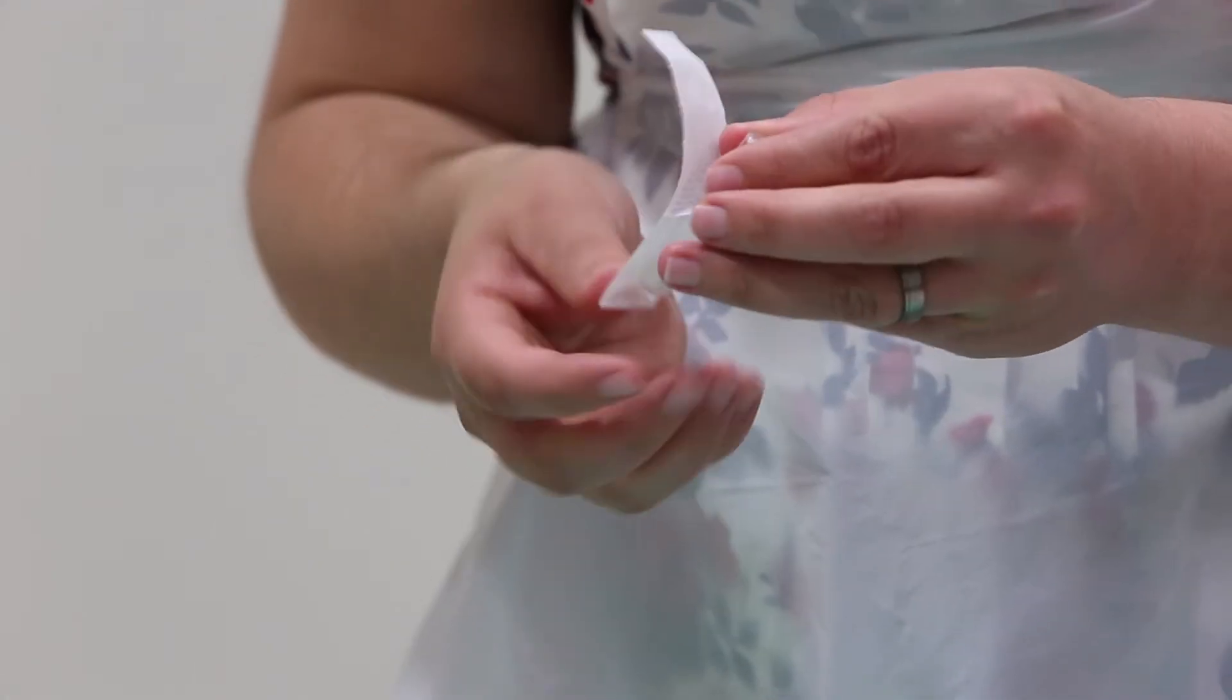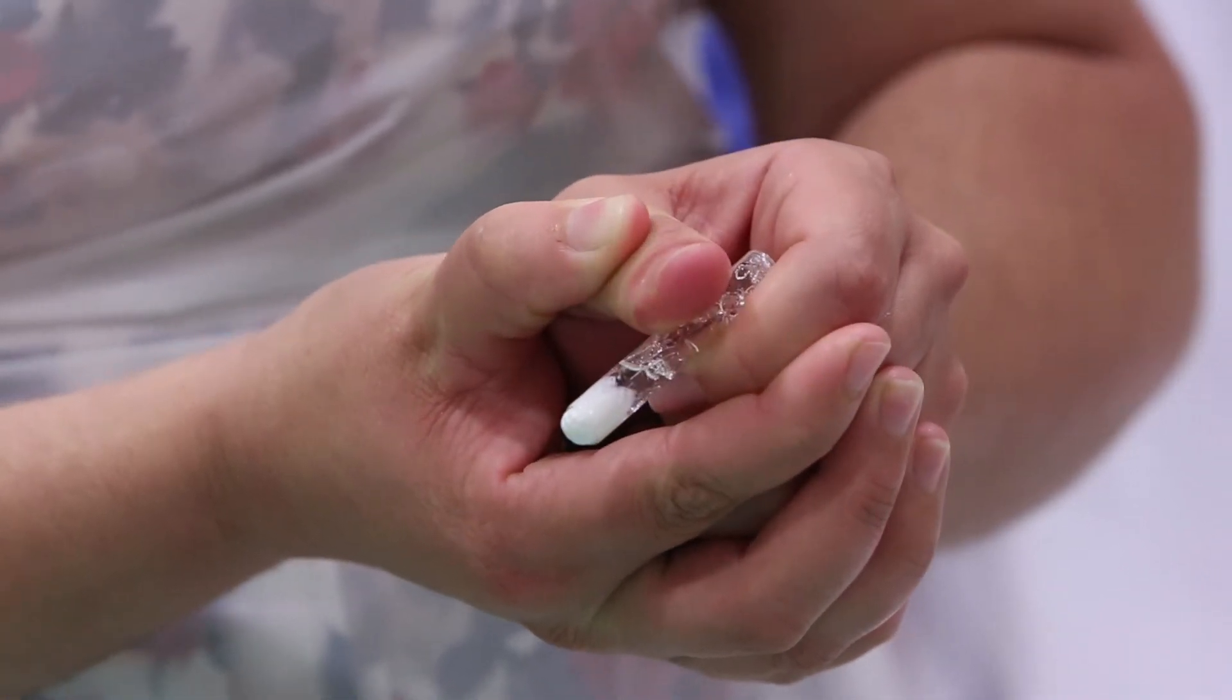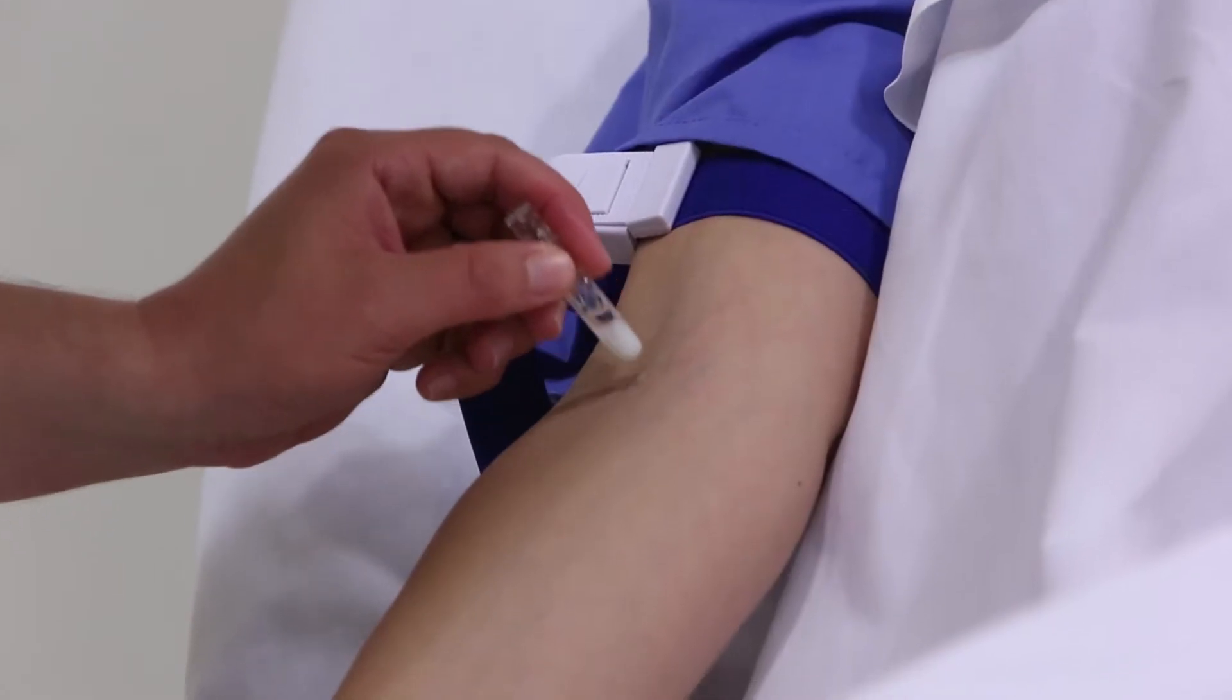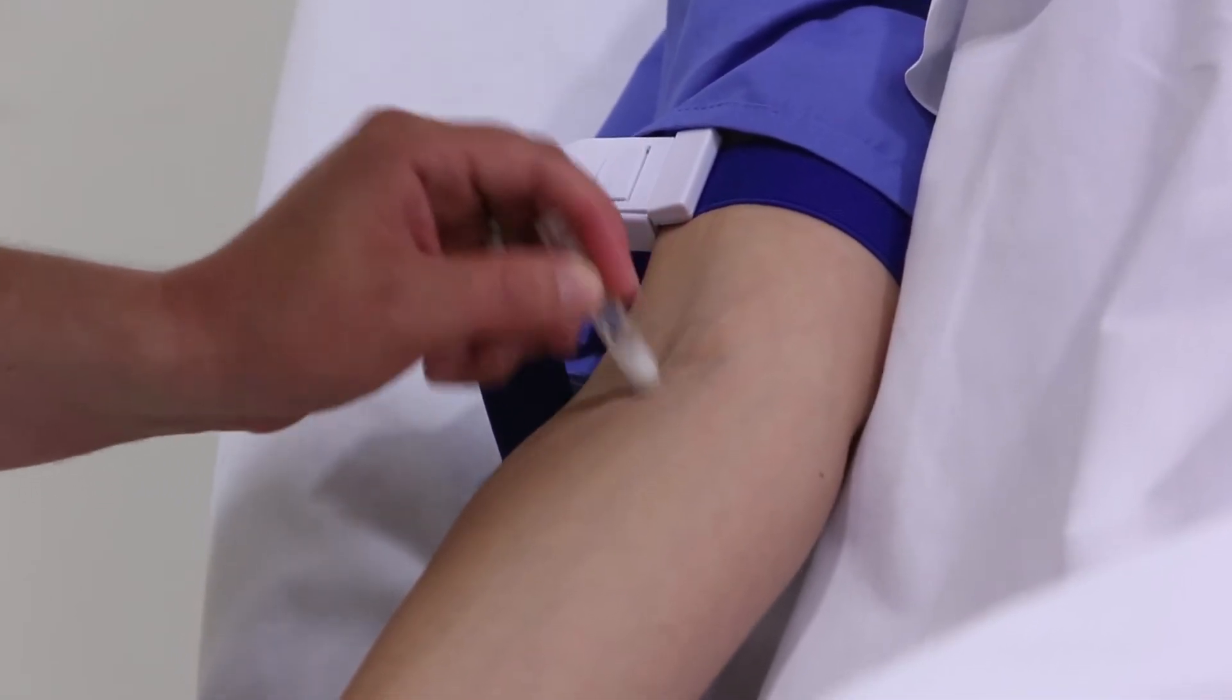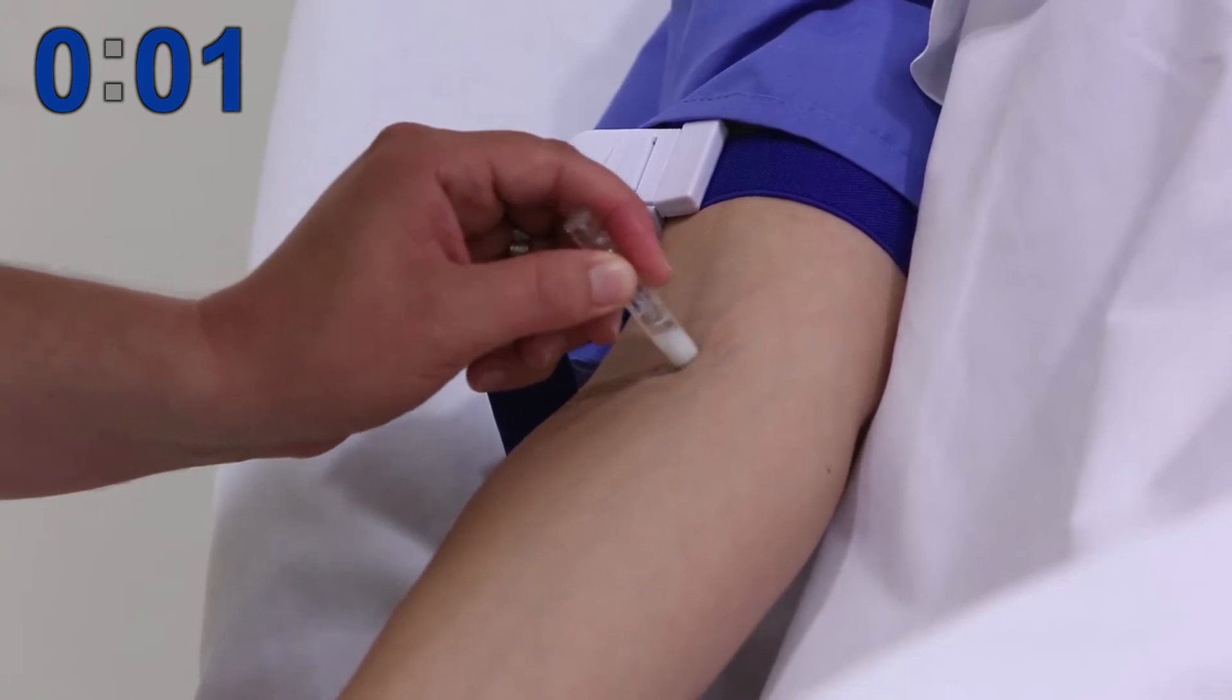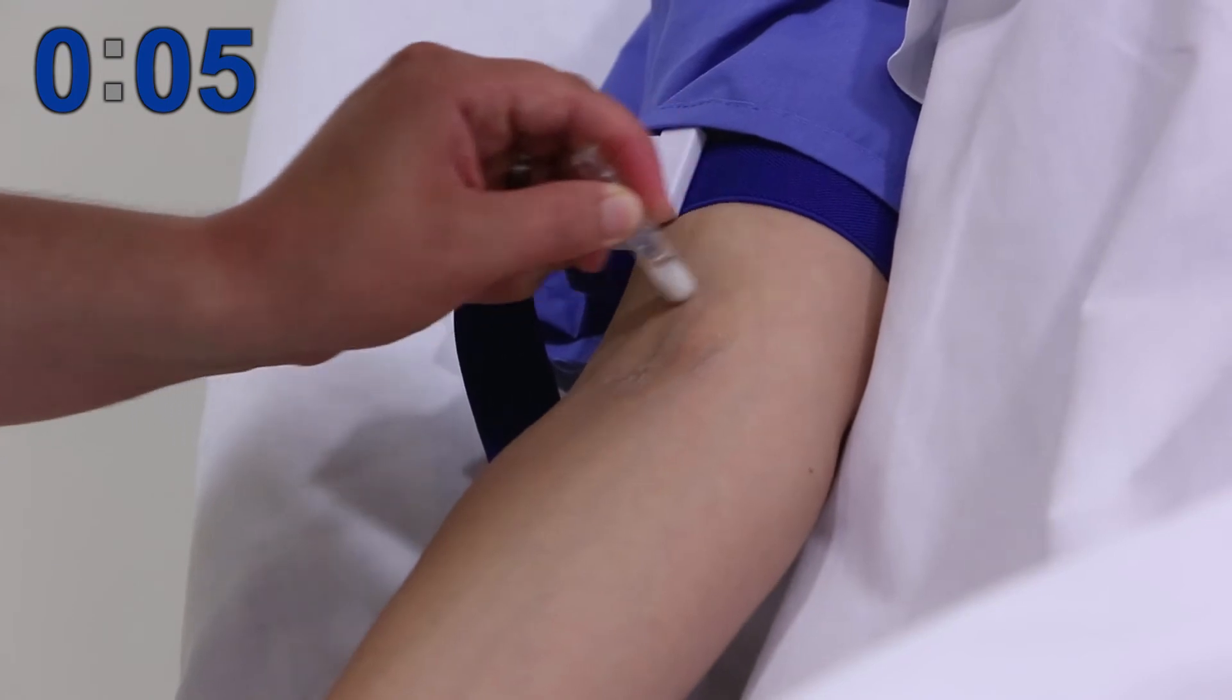Remove the chloroprep applicator from its cover, pinch once and allow the cotton tip to soak. Next, gently dab onto the patient's skin. Proceed to clean the venipuncture site with the applicator starting from the center of the site and moving back and forth in a zigzag pattern for 30 seconds.